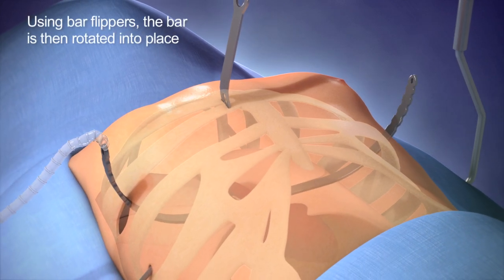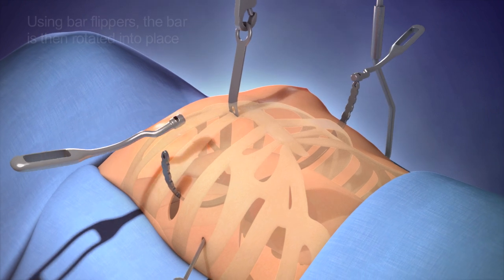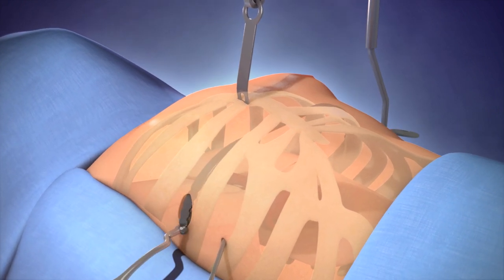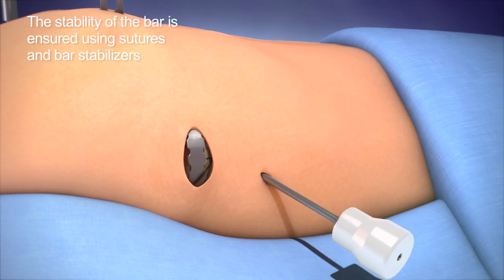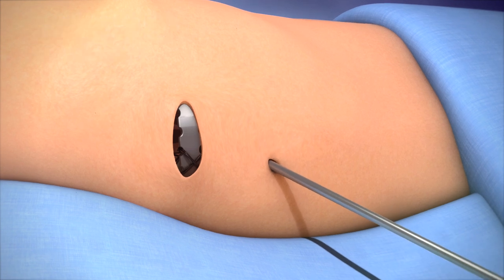The bar is then rotated with the help of two bar flippers. The bar is secured into place using heavy sutures around the bar and ribs, and sometimes bar stabilisers.